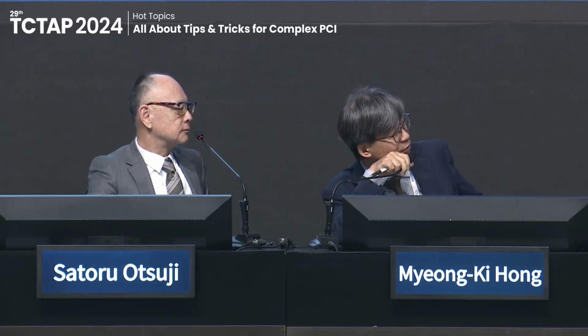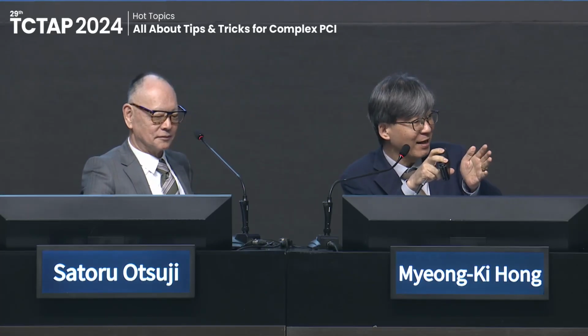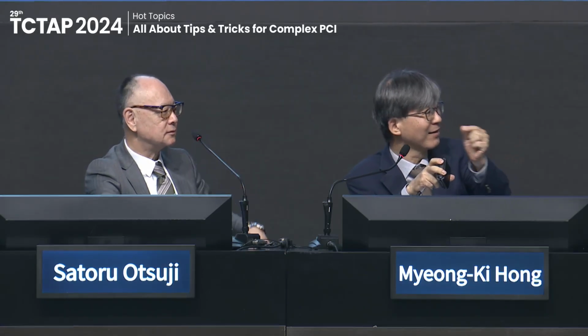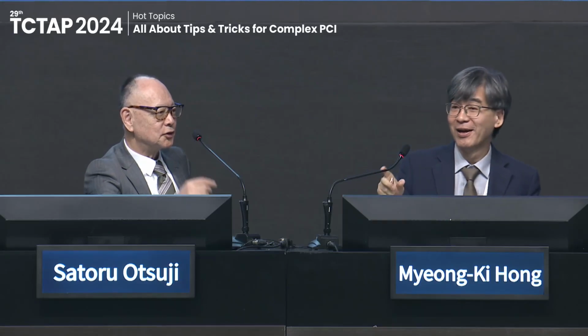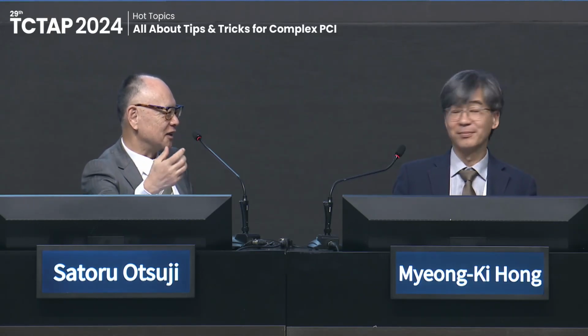The final result of Dr. Han's case is, after the super high pressure balloon, there is some perforation. The site is quite interesting. The counterpart in the severe calcium, it means that the super high pressure balloon perforation is in the normal side, not the calcium side. So usually that is eccentric calcium. Usually the perforated side is a healthy side.